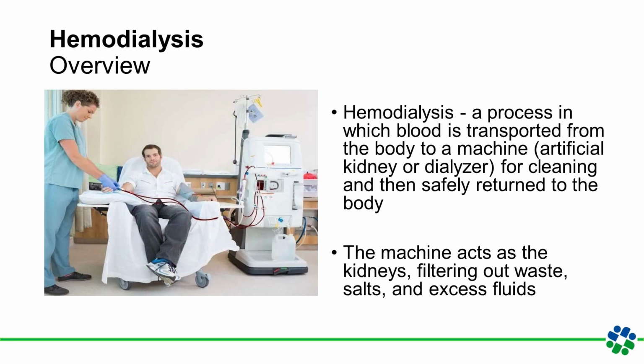So what is hemodialysis? Well, hemodialysis is a lifeline for kidney dysfunction. When the kidneys fail to perform their crucial function due to severe impairment, a medical process called hemodialysis can step in to help. This is a treatment that uses a specialized machine known as a dialyzer, and it is often referred to as an artificial kidney. Well, here's how it works.